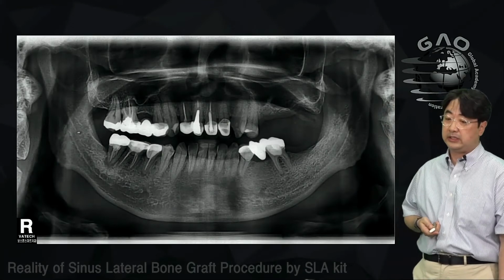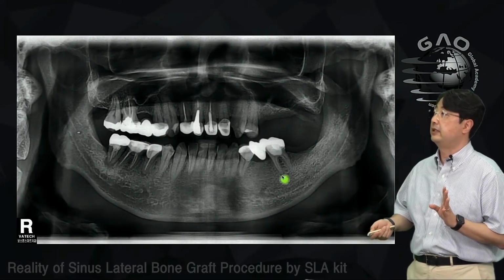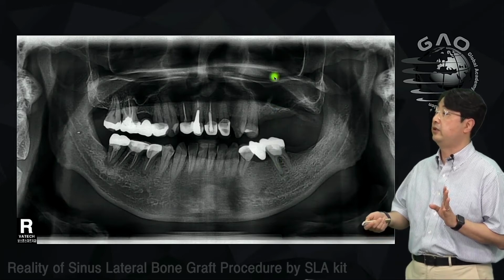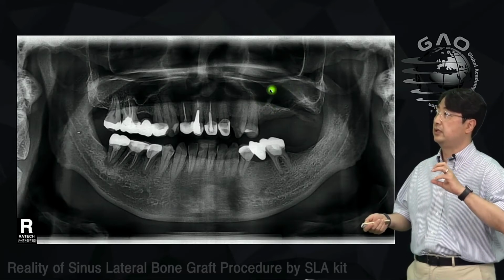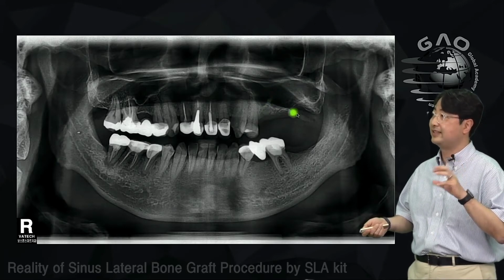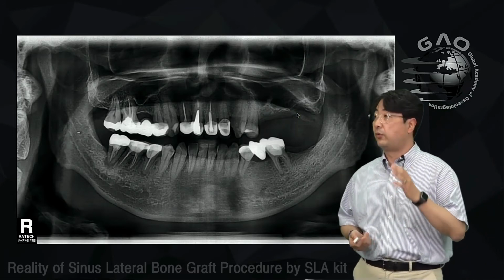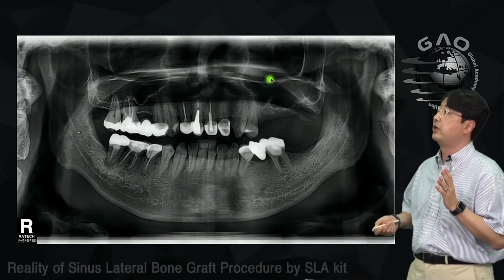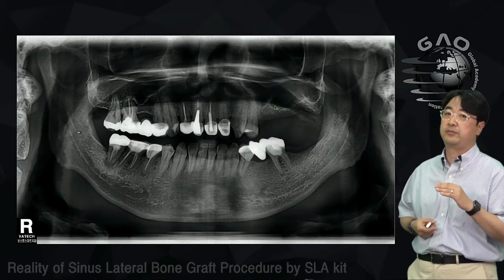Now I need to place implants, but as you see here, there is a septa right here, and you see there are different loops, right? So this septum divides two different parts. This part has a little bit of bone, but this part has less bone from the crestal area. So what I decided to do is the crestal approach for this front implant, and the lateral approach for this posterior implant.